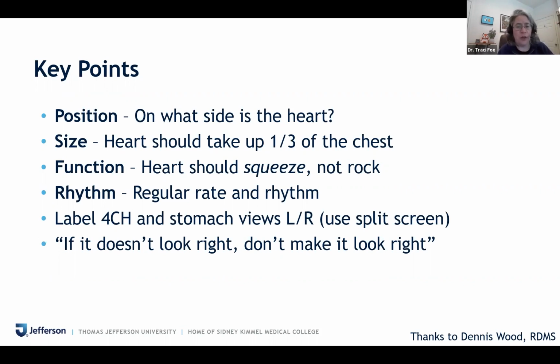If I can't get a 4-chamber heart on a fetus where I should be able to get a 4-chamber heart, I follow the next rule. When in doubt, send it out. Which means if I'm in a radiology center, I'll send it to perinatology. If I'm in a perinatology center, I'll send it to fetal echo, because I'll question it.